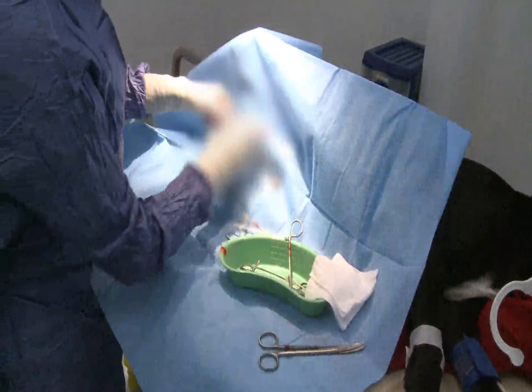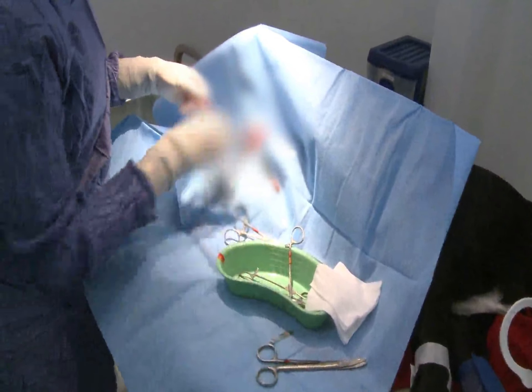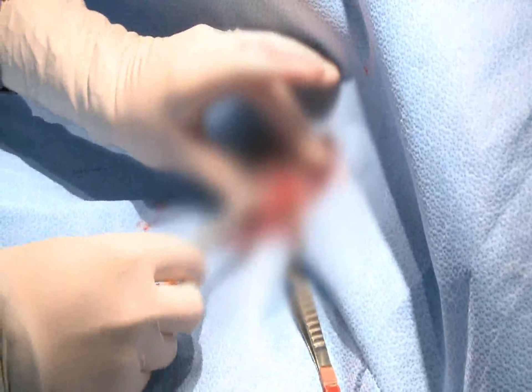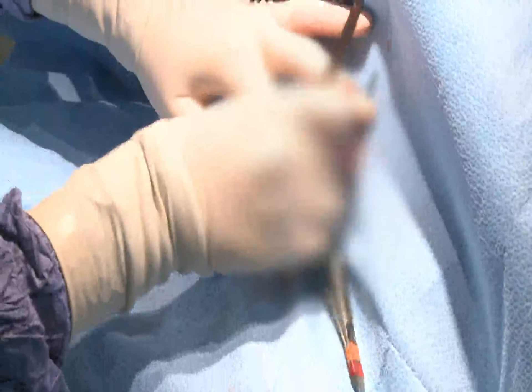Now's the moment of truth when we actually remove the testicle. There it is. Sorry, Max. This is the end of that sac, which I'm just going to let go there — make sure there's no bleeding. And this, more importantly, is the end with all the blood vessels and the spermatic cord. I'm just going to let that go gently and make sure there's no bleeding, and then we pick up the whole thing and just feed it back inside. And then we'll start on the same thing on the other side.